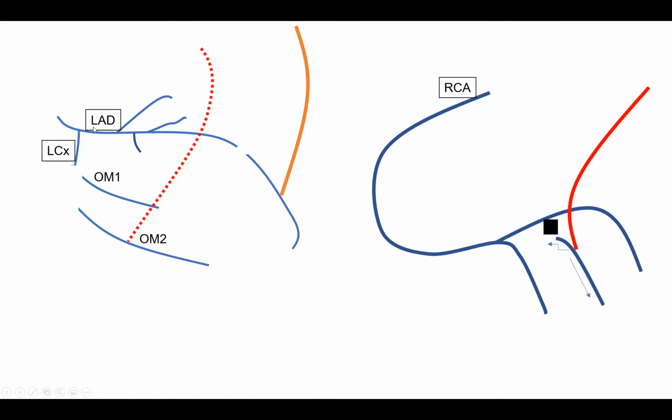Or you can say with 90% obstruction, and therefore that territory is potentially ischemic and causing angina. Now, big number two idea, left circumflex system. Well, the left circumflex has a patent graft to OM2 that doesn't fill the rest of the circumflex. We have an occluded OM1 that fills via collateral, and that is ischemic. It's not receiving any graft flow. So that was our second territory, circumflex.